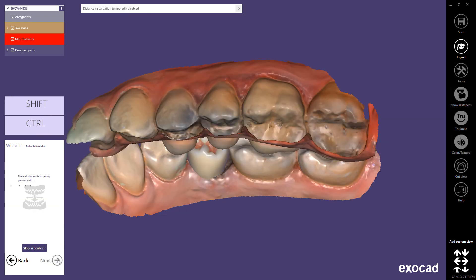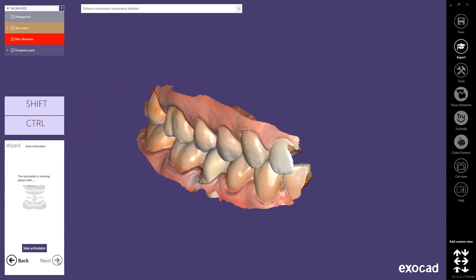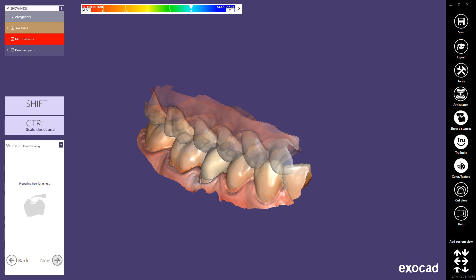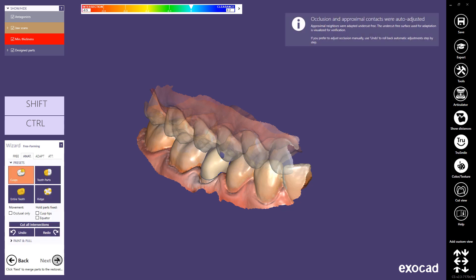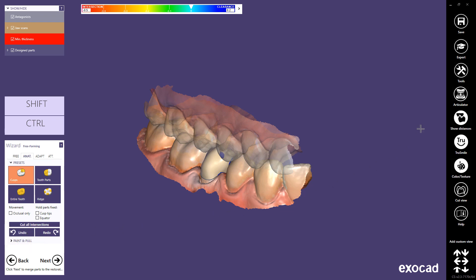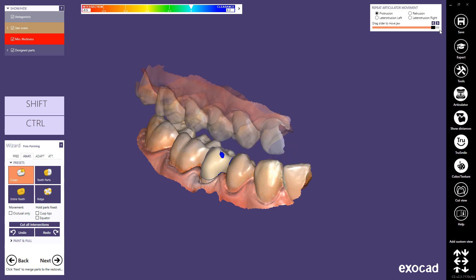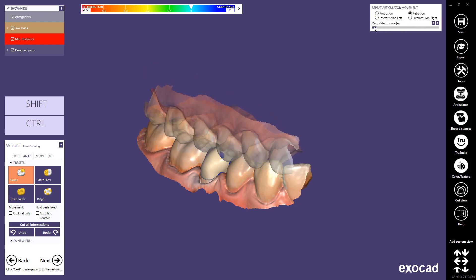Proceed to Next. The Auto Articulator calculation will start automatically and in the main view you can see the articulator movements. If you prefer to adjust all adaptations manually, use Undo. To repeat the articulation movements, select Articulator in the main toolbar once the Auto Articulator step is finished. Select the desired movement using the radio buttons and drag the slider to move the jaw: Protrusion, Retrusion, Laterotrusion left, and Laterotrusion right.